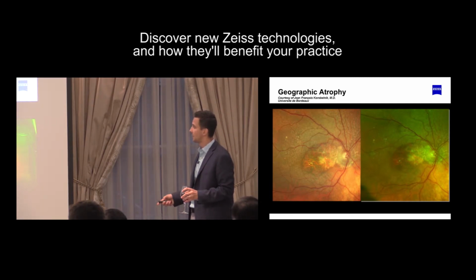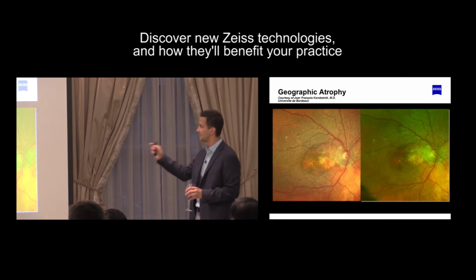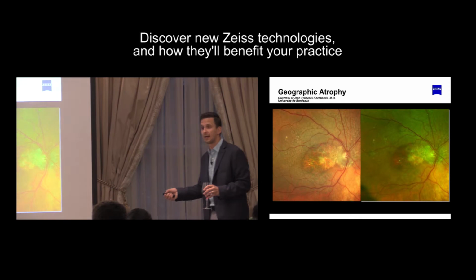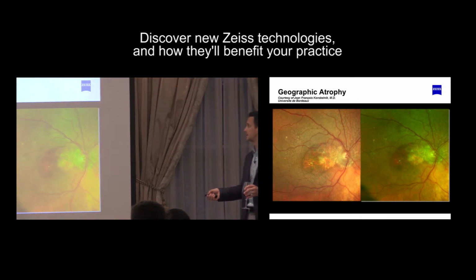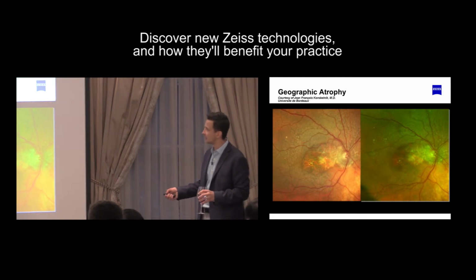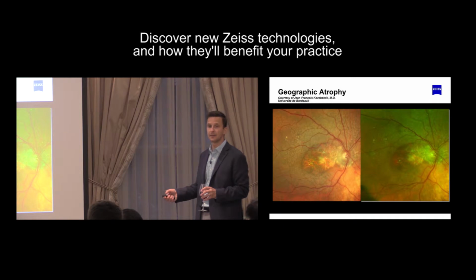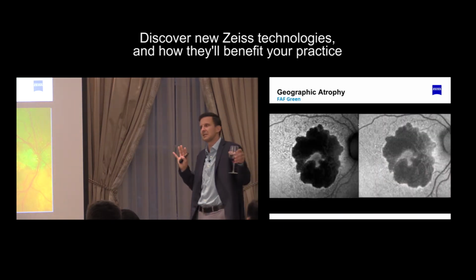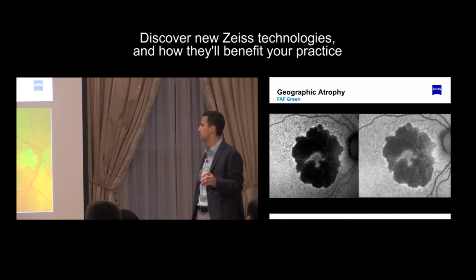Now if I blow those 2 up and look at the quality of the images centrally, you can see the difference, where this is really a true retinal camera with the level of detail, versus the fogginess and fuzziness around the edges, and even the distortion. This is a non-distorted image. Remember, by the way the image is taken, nothing gets stretched and spread all over the place, so you don't have to tease out what is normal and what's abnormal within it.